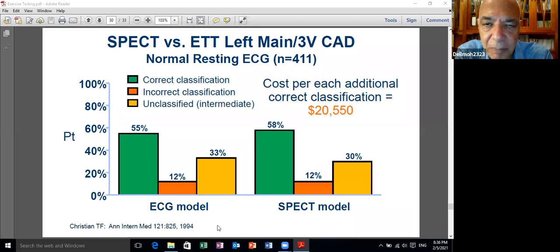مين الابروبريت بيشنت؟ واحد عنده symptoms، واحد عنده readable electrocardiogram، واحد كان اكسرسايز، وواحد من الانترميديت بري تيست probability. هم دول اللي احنا بندور عليهم. حكايه بقى ان العيان يجي نحطه على التريدميل ونشوف التريدميل هيورينا ايه، ده مش appropriate thing.